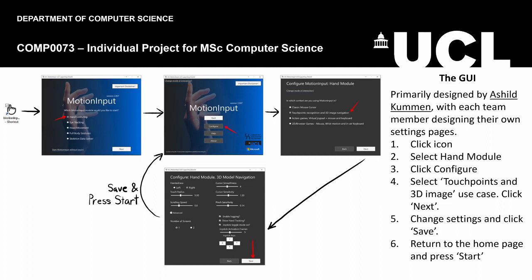And on the left, you can see a sort of user flow for how you would go through to select my use case and start using the features that I've incorporated into the framework with my project. So basically, all you need to do is begin by clicking the motion input icon, and then you choose the hand module next. Then you go back to the home screen where you click the configure button, and that's where you can select the different use cases within the hand module. And what you really want to select is the touch points recognition and 3D image navigation use case.